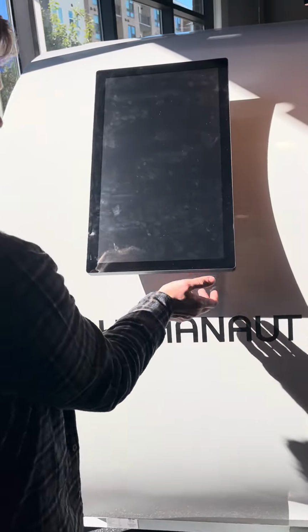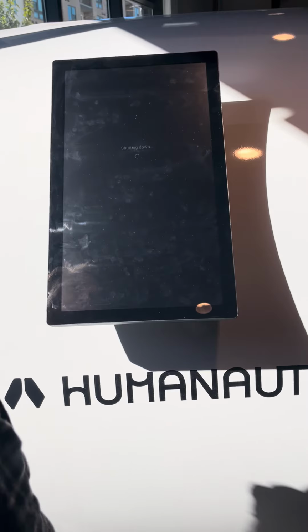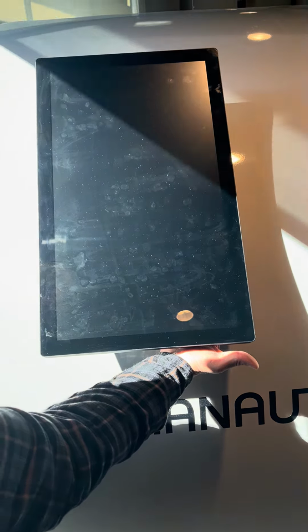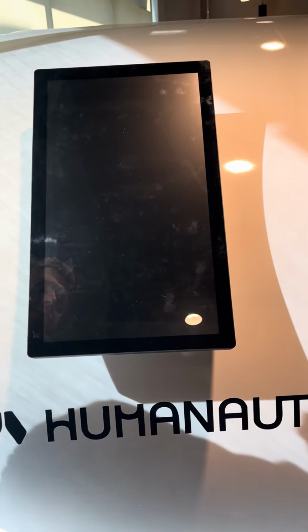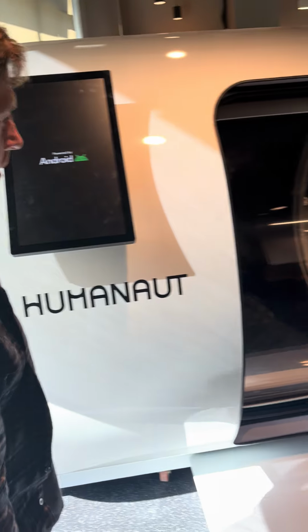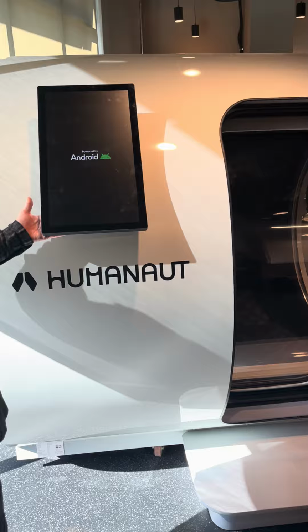Tablet is on. You can see loading down here, but we'll power it off. Act like it's not on. Switch in the back, hold it for 5 seconds. It's gonna boot on eventually. If not, touch it again. And then same thing with the tablet inside. I think the switch is on the lower left side.